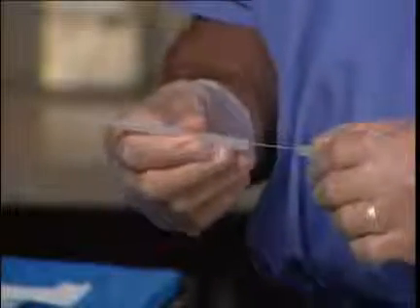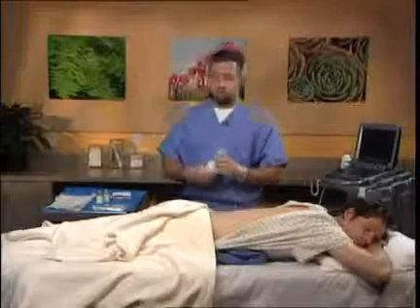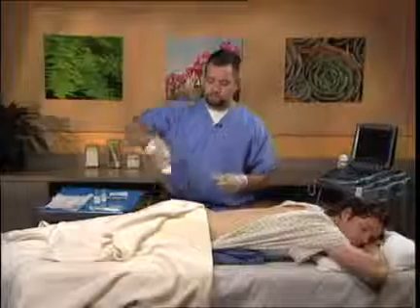A 3.5 inch, 25 gauge spinal needle will also be utilized for the procedure. Sterile 4x4s are necessary to clean the area at the conclusion, and a simple band-aid will suffice to cover the wound. Copious amounts of gel are required for this particular procedure.